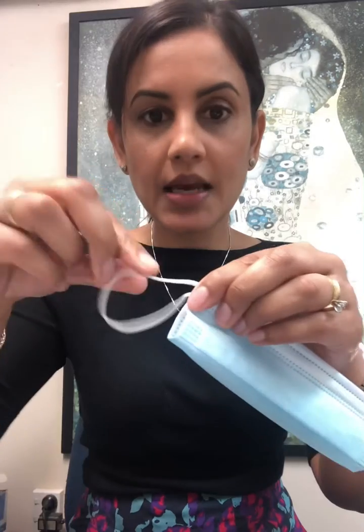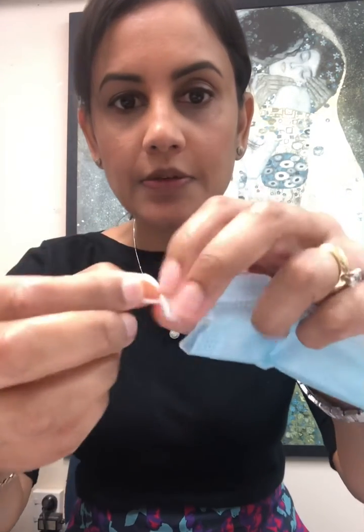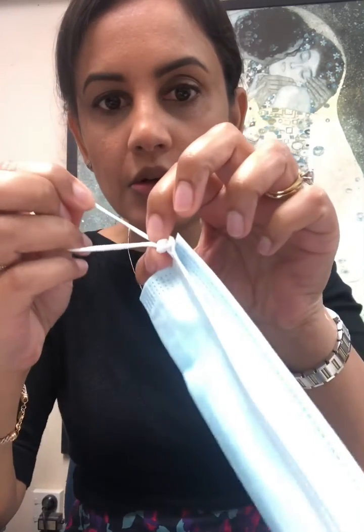So what you need to do if you've got a small face like mine is take the loops and make a knot close to the base, right next to the mask like so, then pull the knot all the way to the end.